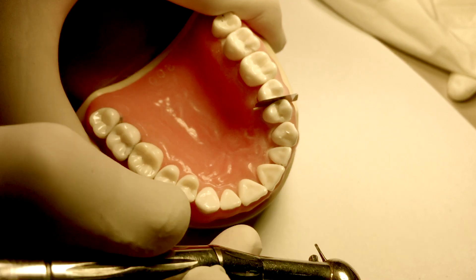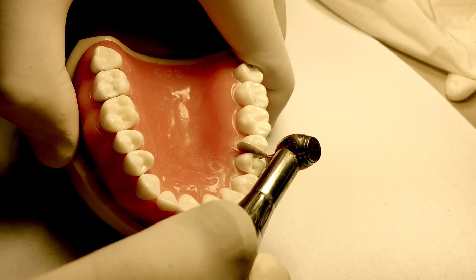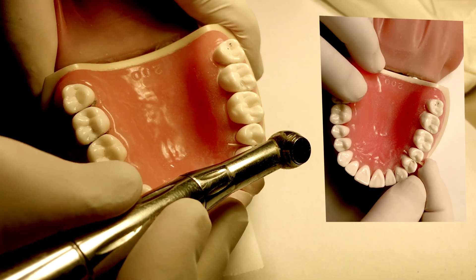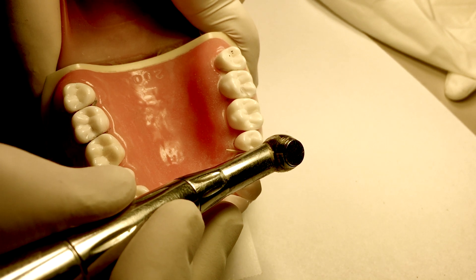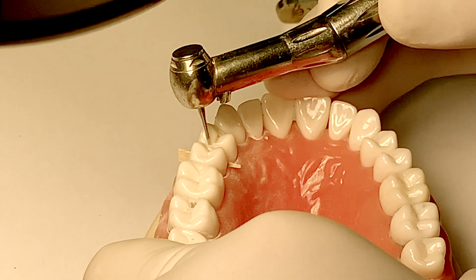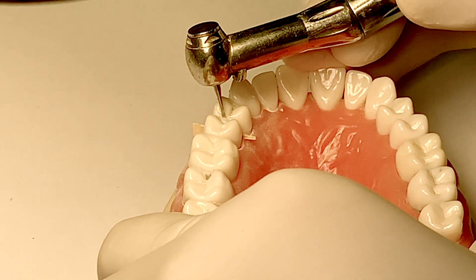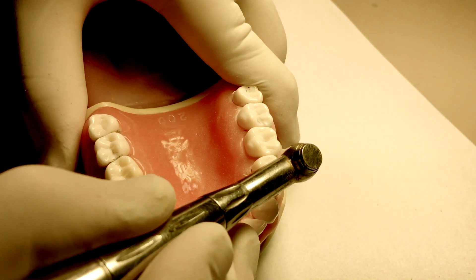At this point you have not broken contact. You are using the matrix band as a reminder not to encroach on the adjacent tooth. You could also use a wedge as a reminder to make sure you're not encroaching on the adjacent tooth. As you become more comfortable with the class 2 amalgam preparation, you can remove the wedge and matrix band as you extend the prep towards the adjacent tooth.